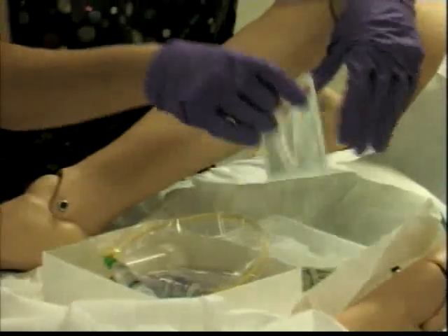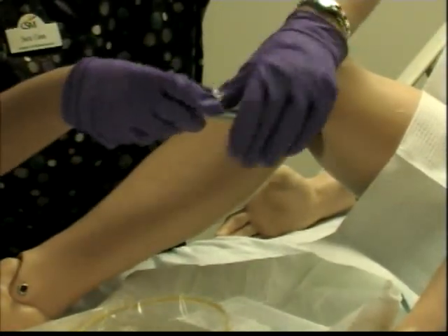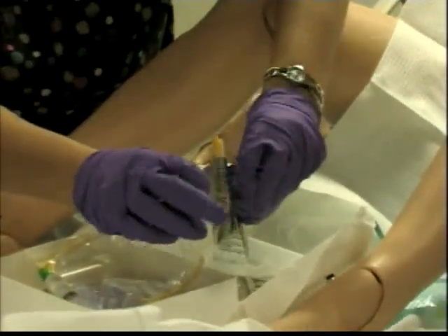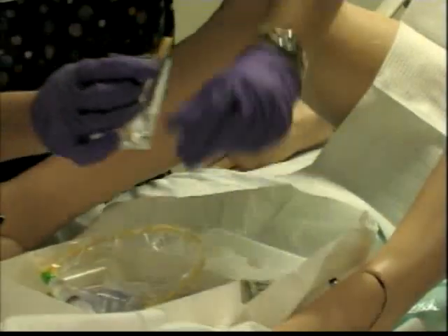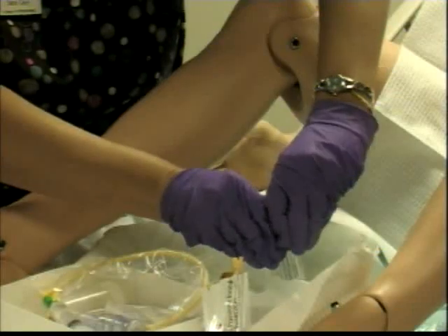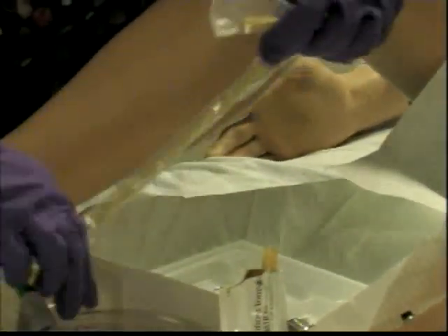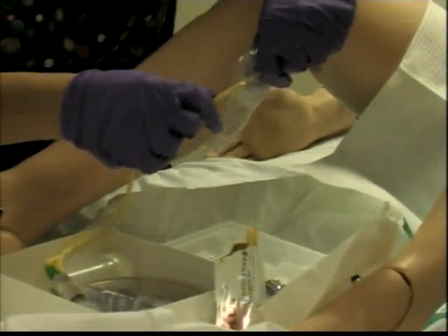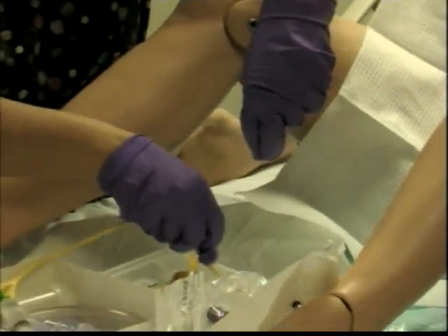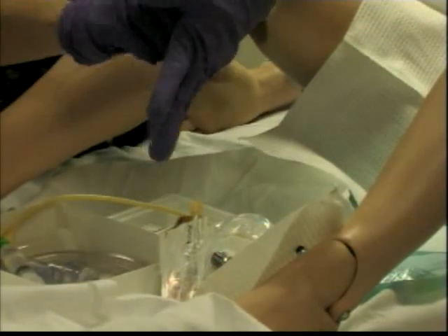Next, I'm going to open all my packaging and have it available — because once I use my non-dominant hand to clean the client, that hand can no longer return to my sterile field. I'll open everything and make sure it's all ready. Then I'll open the lubricant and put it all into the little reservoir. I'll remove the catheter from its package, maintaining sterility of this area, and lubricate very nicely — about four to five inches — to make it as comfortable as possible for the client.